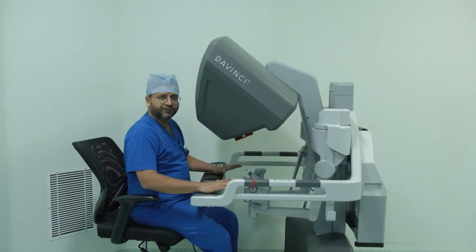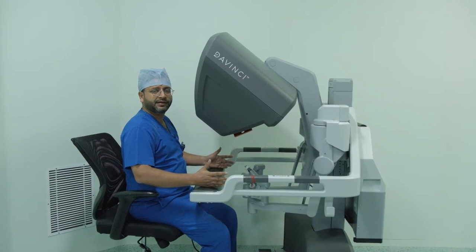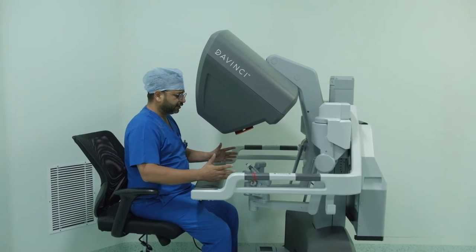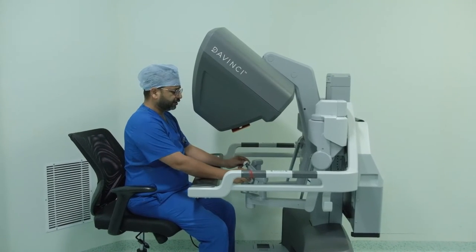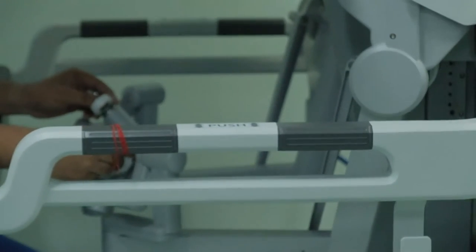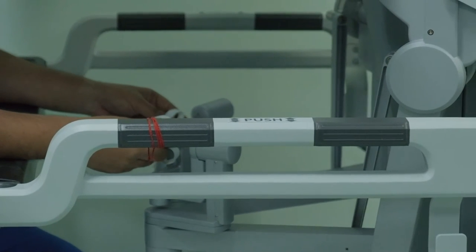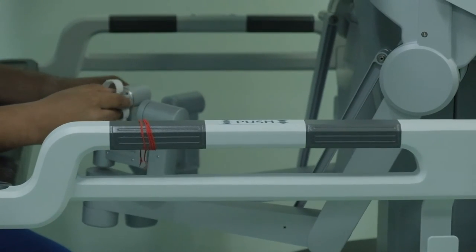So we sit on the master console, we create the ergonomics to our own height as well as stature, and then once you are at ease, you take control of the hand controls and you look into the stereo viewer. For these hand controls to move or the instruments to move, we have to match the grips. Match the grips means we have to press the hand control and then match the grips.